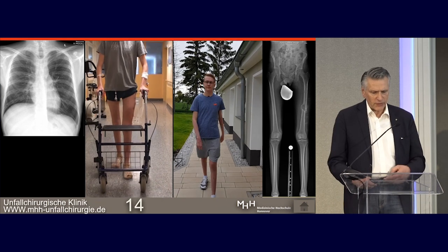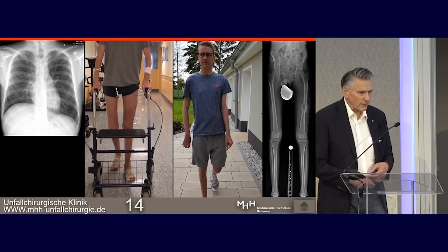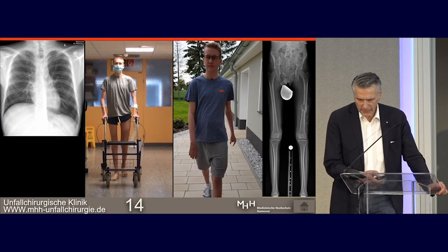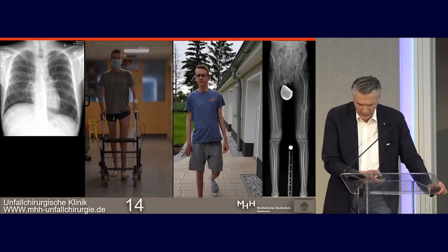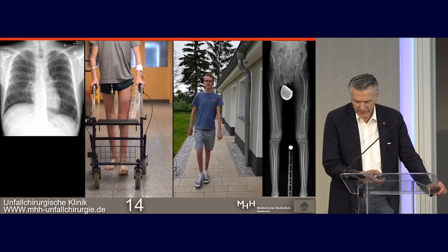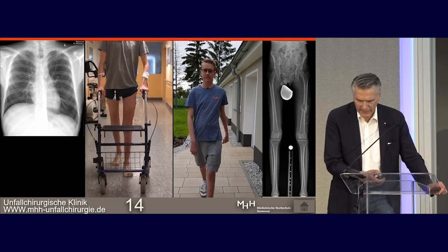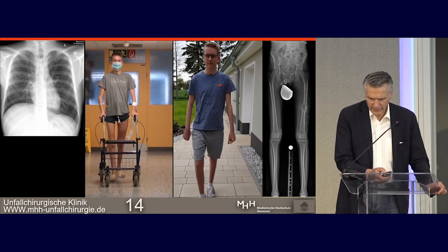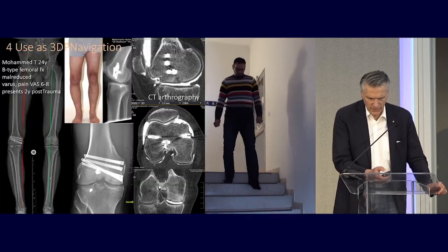Here's a chest X-ray with a new lung. Looks almost like a normal lung. It's really amazing what this lung transplant can make. What a difference. On the left side, the long-standing films, nicely brought out to length, no torsional difference, and sound fracture healing on its way.